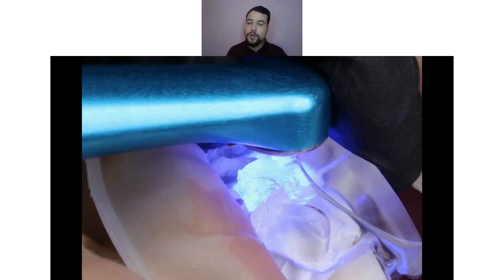After that, we go for final light curing for 40 seconds from vestibular, 40 seconds from incisal, and 40 seconds from palatal. Here I'm doubling the time of exposure to the light, not because the silicone is not clear. It is totally clear, and the light goes all the way through it. But because of this transparent silicone, we have some barrier from the light to the composite. And as you all know, with a bigger distance, the power of the light curing lamp decreases. So to be sure everything is well polymerized, I'm doubling the time of polymerization.